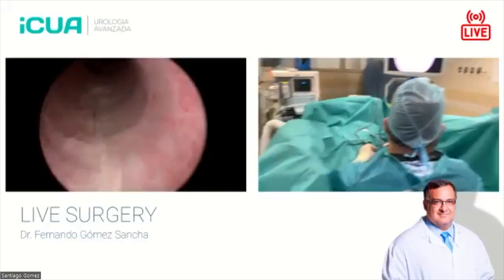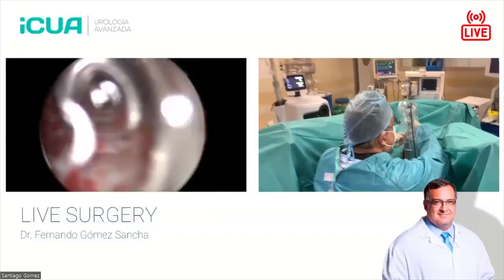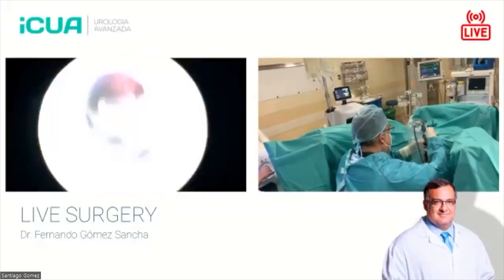Now you can see the urethra, right? Yes, we see it. Okay, there are some bubbles. I don't like bubbles. I don't know why I have so many bubbles.